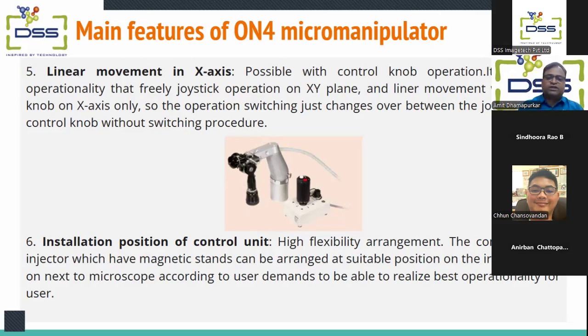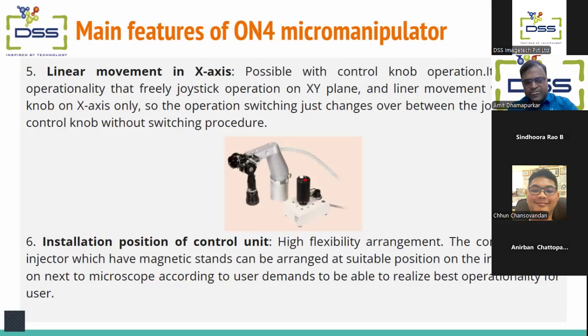Sometimes, because of the joysticks, we may lose the angle. Using this homing device, the ICSI procedure becomes very fine and the sperm injection is very easily done.